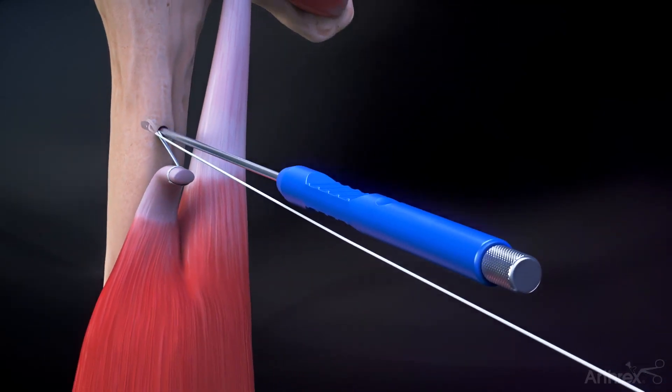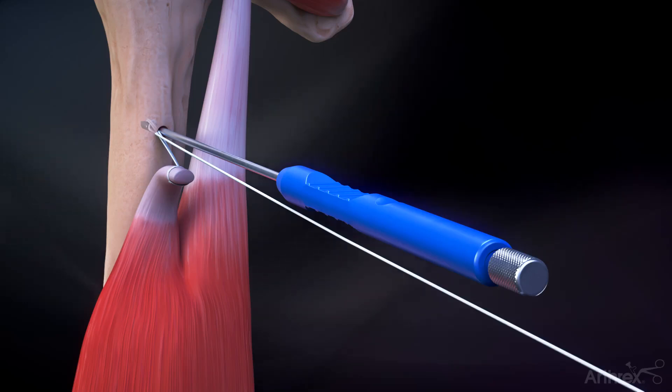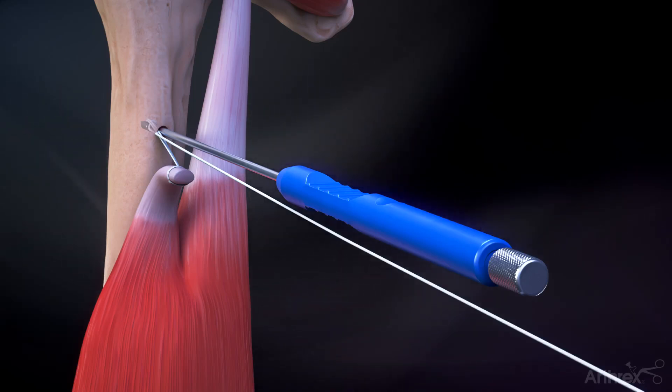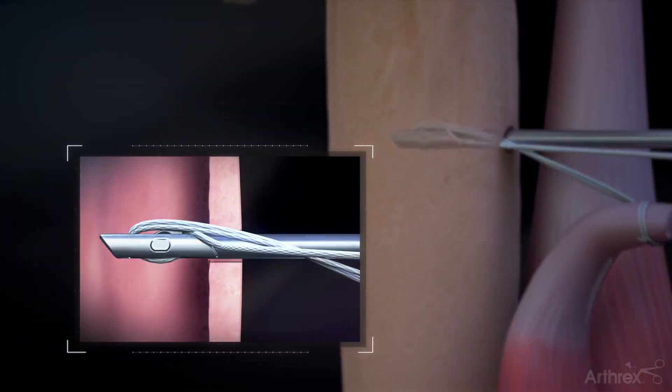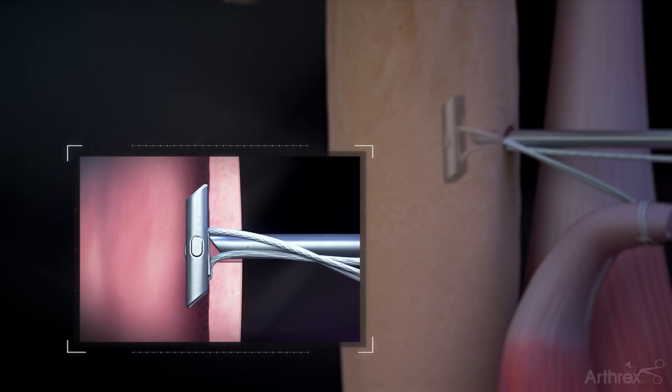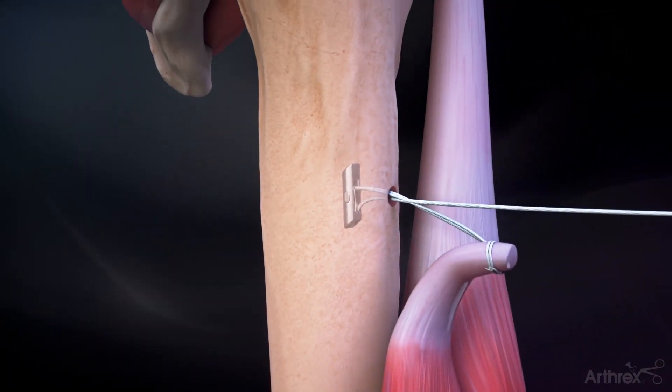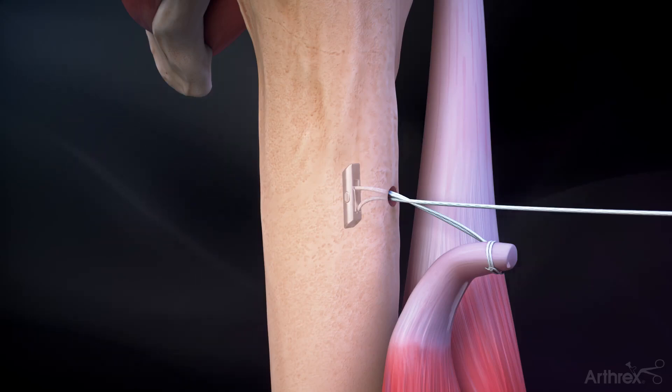Insert the button into the tunnel. Turn the threaded inserter counterclockwise to release the button. Remove the threaded inserter. Pull on the suture to flip the button in the canal. Remove the inserter shaft once the button is deployed against the near cortex.